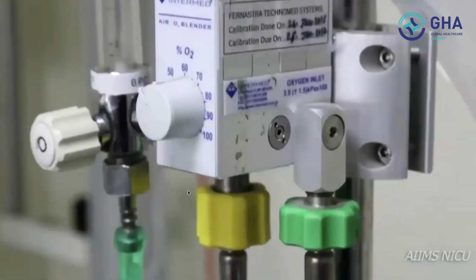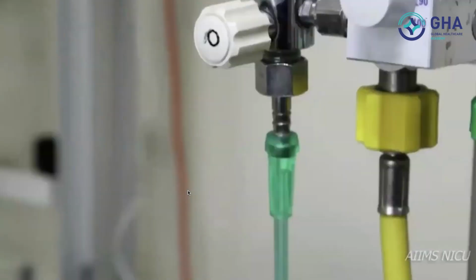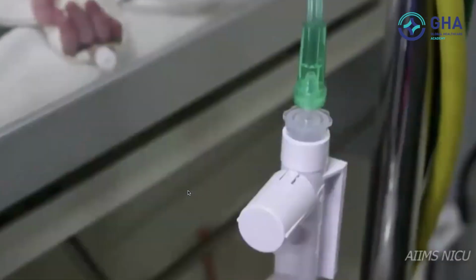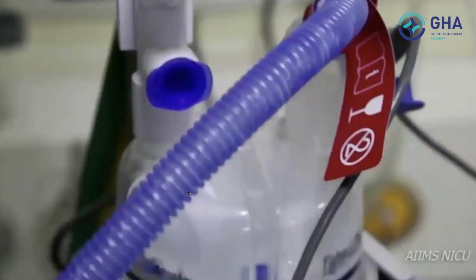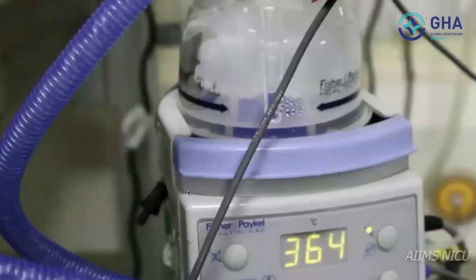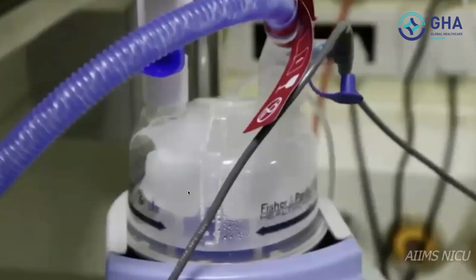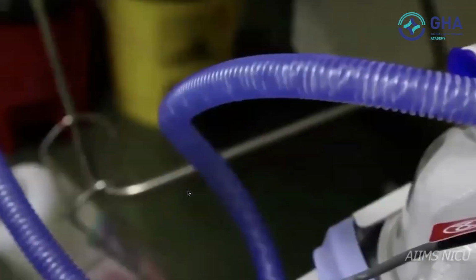Now watch through the gas flow for any leaks in the circuit. Set flow and FiO2. Water in the humidifier chamber. Temperature on the humidifier, the heater wire and heater wire probes.